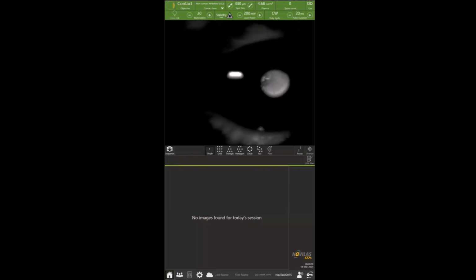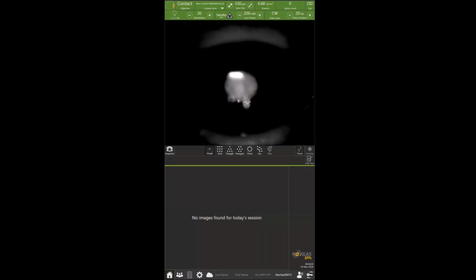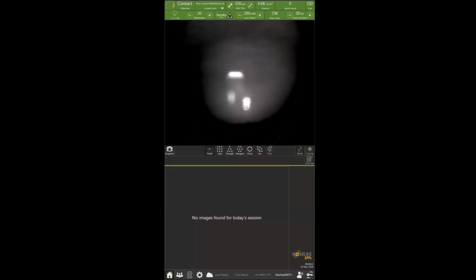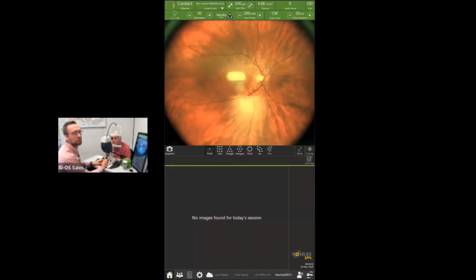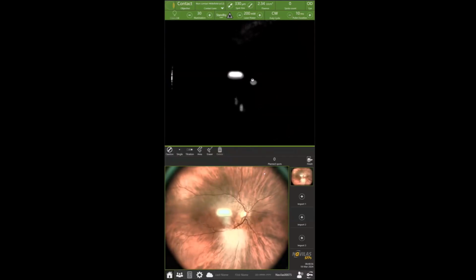working distance doesn't actually influence the refraction of the objective, so you can adjust the focusing without being in close proximity to the eyelashes. So the patient can blink, and you do not need to restrict him from that. Once you have your lines vertically adjusted, you can slowly start moving the device base towards the patient's eye, avoiding the eyelashes and not moving closer than this. Right after making a picture, pull back the base and make sure it doesn't stay close to the patient's eyelashes.